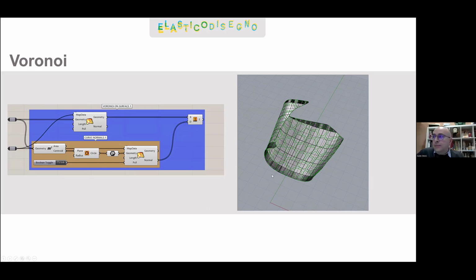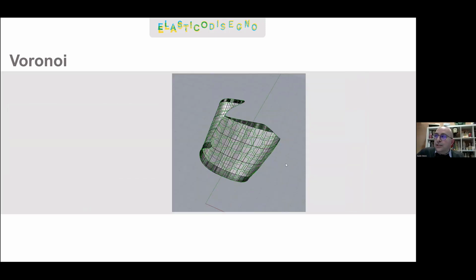In the beginning, we just thought of using these curves to split the surface and then use the solid offset command to do that. But something wasn't working right, and so we had to go through a slightly more complex process to create a normal for each cell. So we took the centers of the cells, created a circle for each point, created a plane going through each circle, and only considered the z-axis of these planes as the normal of each cell.